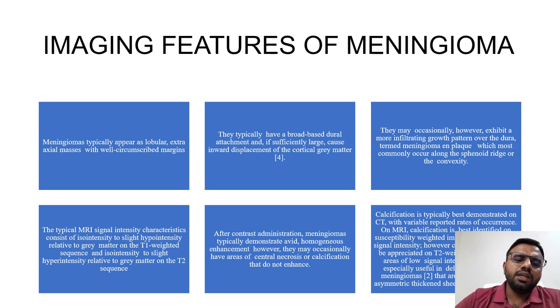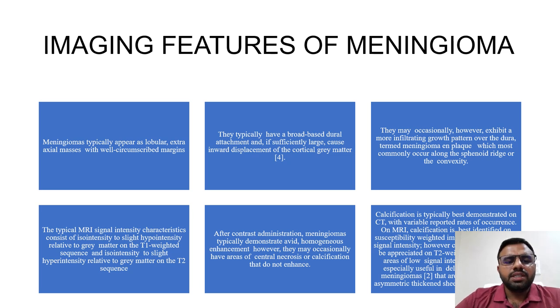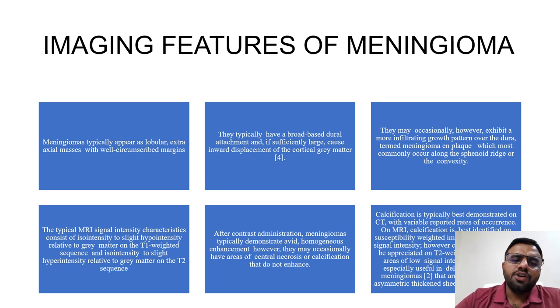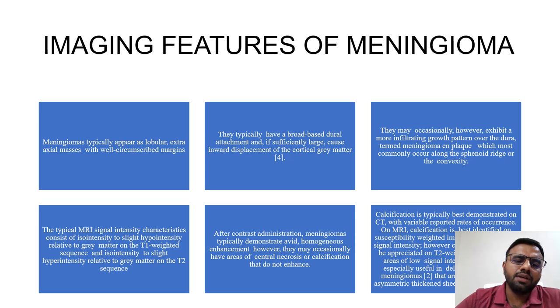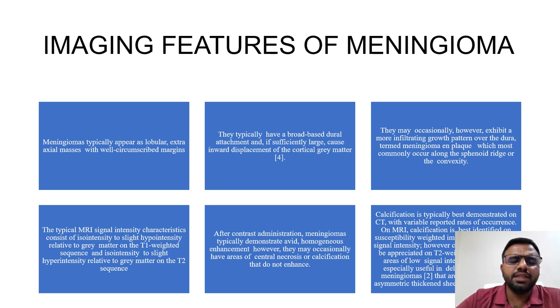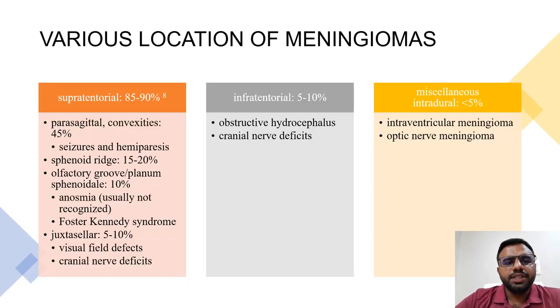Calcification is typically best demonstrated on CT. On MRI, calcification is best identified on susceptibility weighted images as areas of low signal intensity, and may also be appreciated on T2-weighted sequences as areas of low signal intensity. Contrast is especially useful in delineating en plaque meningiomas, which are typically seen as asymmetric thickened sheets of enhancing dura.